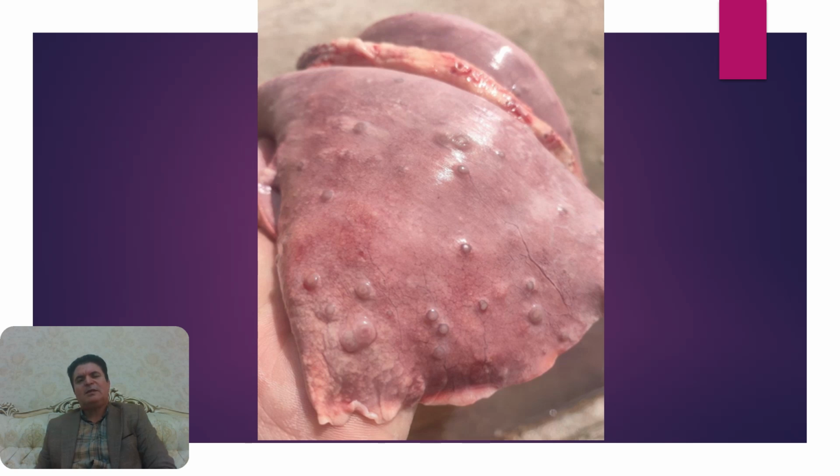My diagnosis and his diagnosis were a parasitic pneumonia based on these focal lesions. How about you? Do you agree with us?